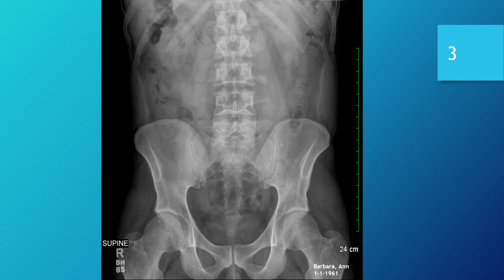Okay, well, once again, we have an abdomen here. Pretty obvious, isn't it? Yeah. But anyway, we'll just jump right into it like we always do and start from the top. So, is all the required anatomy present in this exam? Well, we definitely are able to identify the pubic symphysis, and then some. And as far as the inferior aspect of this image goes, yes, we have all of our required anatomy. It is present on this exam, absolutely.